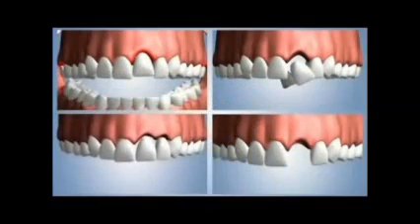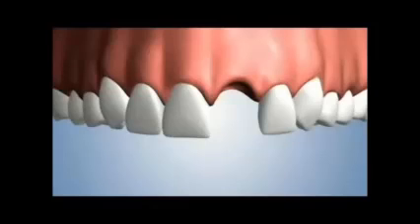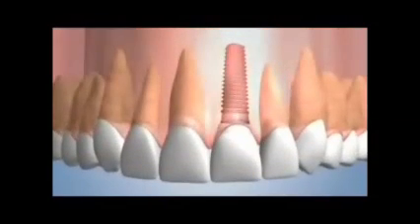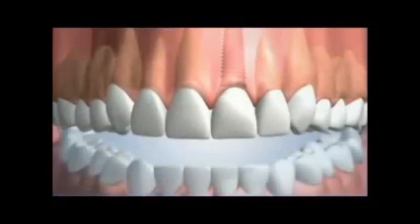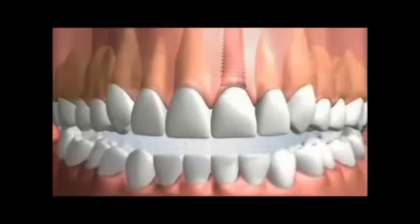to another failed bridge. The fourth option replaces the natural tooth root with a dental implant that is inserted into the bone. An abutment is secured to the implant, and a crown is secured to the abutment. The dental implant option closely mimics the design and function of your natural tooth. The dental implant is the most secure option, with a solid foundation of bone that keeps it stable, withstanding the forces of biting and chewing.